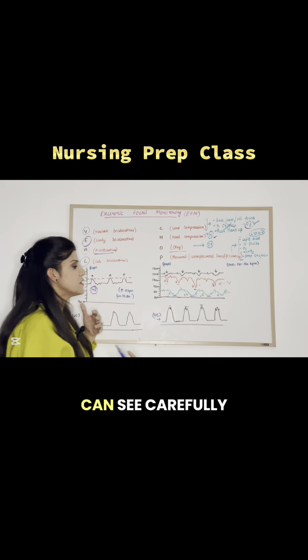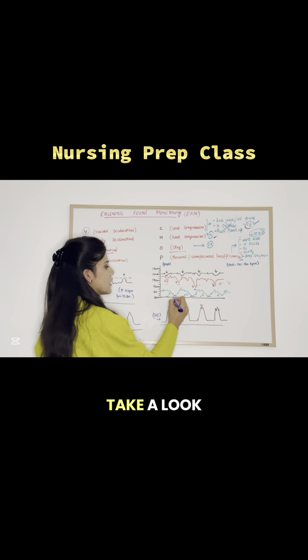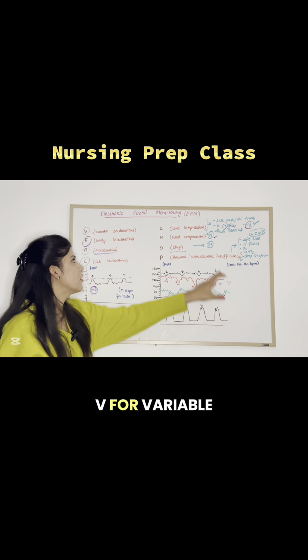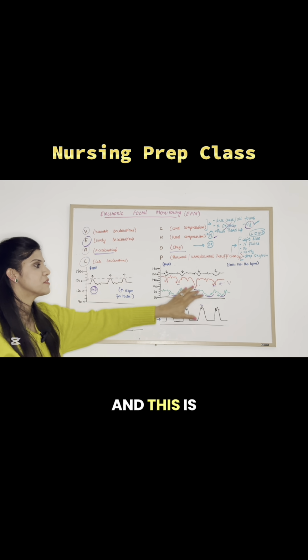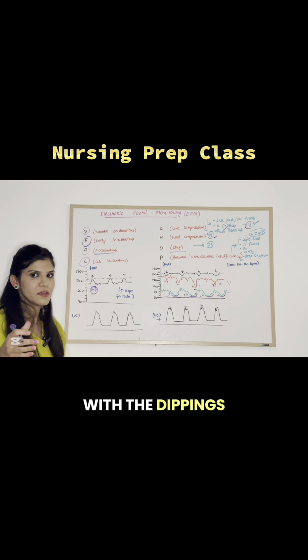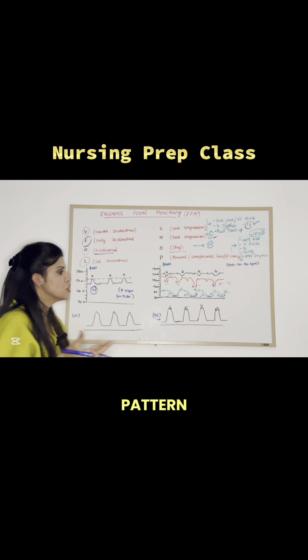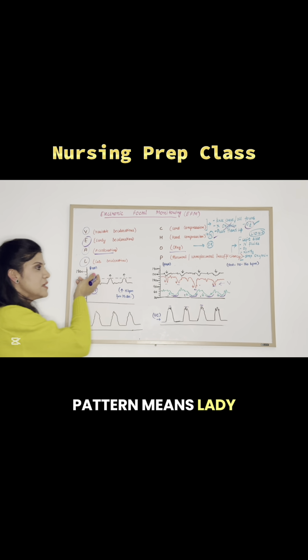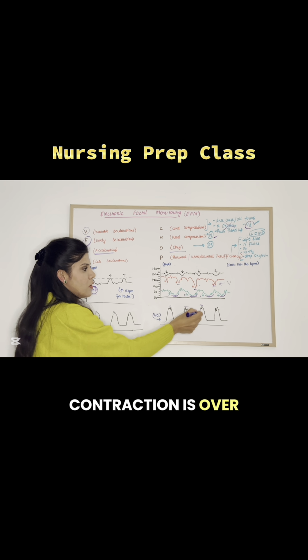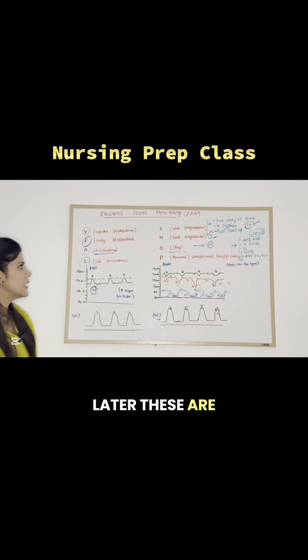So if you can see carefully, in late deceleration you see a U-shaped pattern. So take a look at this, like this, and right here. We have V for variable decelerations in the graph, and this is actually how you can spot this graph. You can spot this graph with the dippings showing us some U-shaped pattern. Rather than V, we are looking at a U-shaped pattern. So U-shaped pattern means late decels, and obviously they will be coming after the uterine contraction is over. So after uterine contraction is right here, it is coming later. So these are late decelerations.